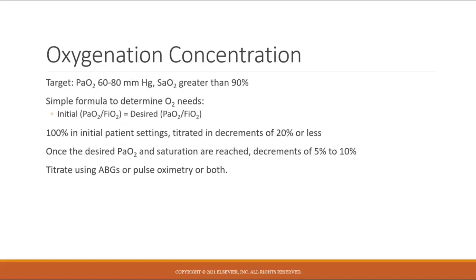So that mildly hypoxemic range is perfectly acceptable, especially because, as you may or may not remember from CP Phys, your PaO2 decreases as we age. So you want to keep that PO2 somewhere between that 60 and 80 range. A little bit higher is fine. As your PO2s get much over 90, you should be really considering weaning the patient's FiO2s or their PEEPs. This gives you saturations above that 90%.